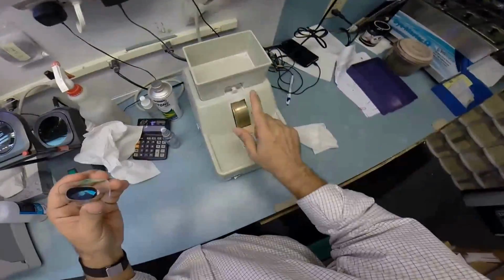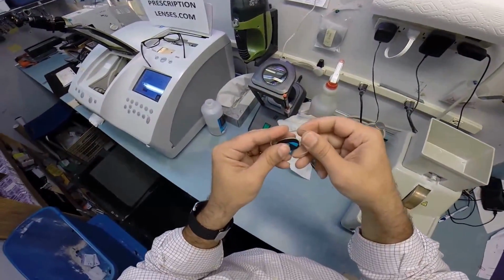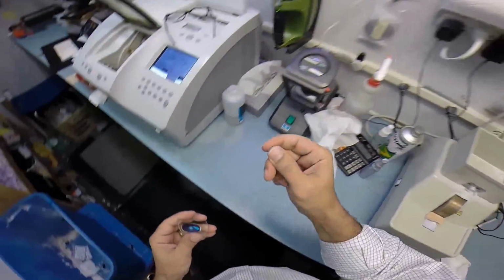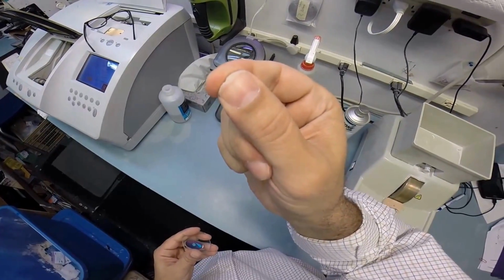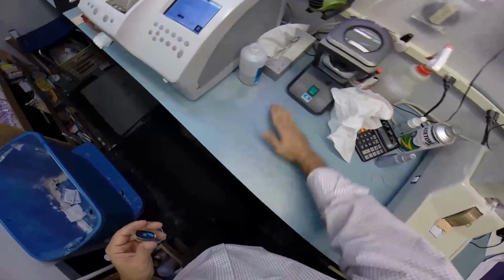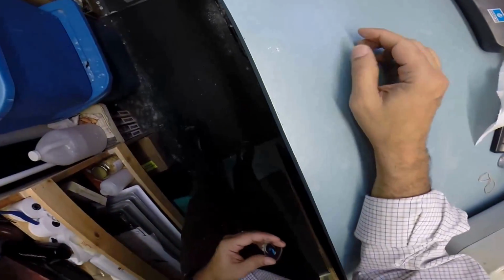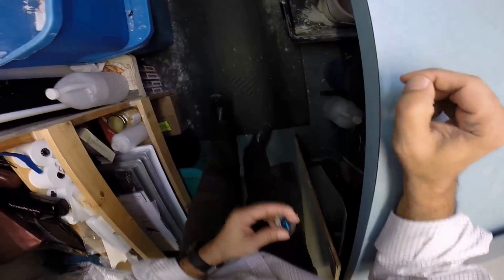By the way, I just applied the safety bevel onto your lens. You had some rough edges there that I smoothed out. I used my thumbnail. Look at that. I've got a V-shaped bevel in my thumbnail because I scraped the edges so much in the course of a day. But once it's all on the counter, I collect it very neatly and responsibly into one pile, and then I wipe it on the floor.